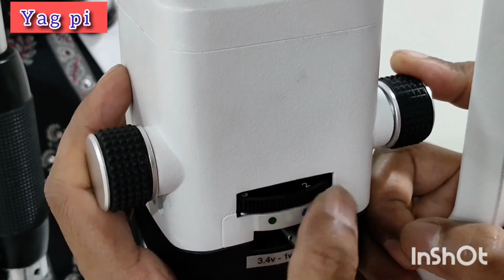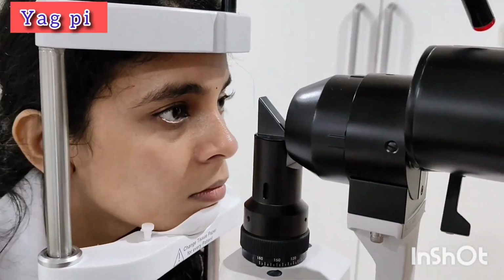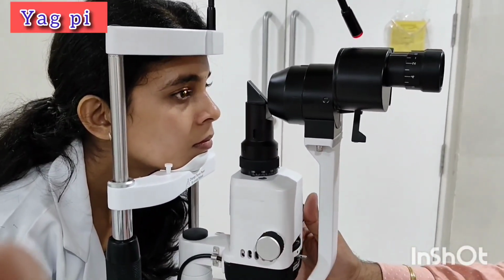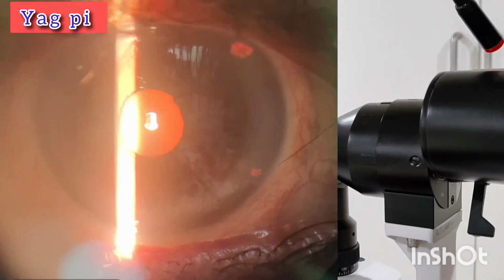To see YAG PI patency, use a 3 mm aperture and focus the light in retroillumination. Locate the YAG PI area and observe the reflected light from the YAG PI.